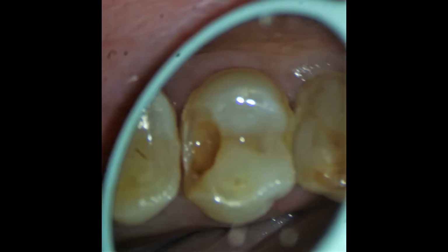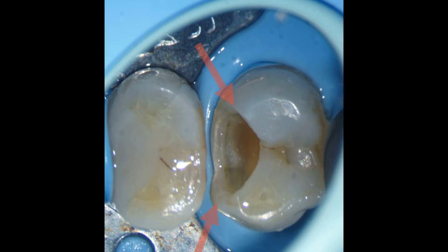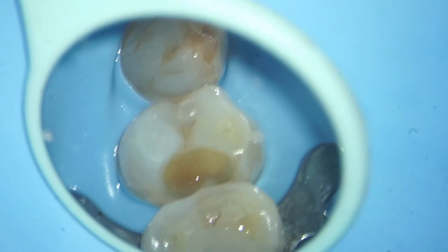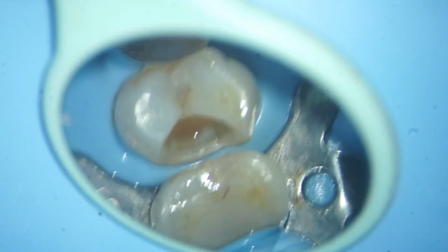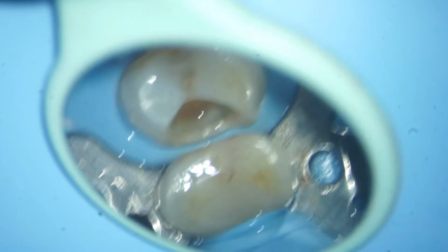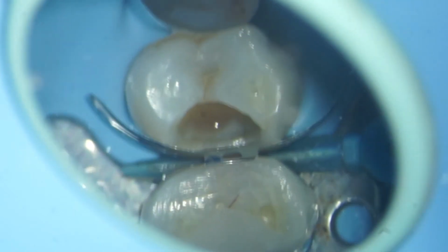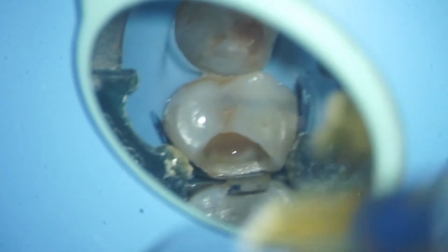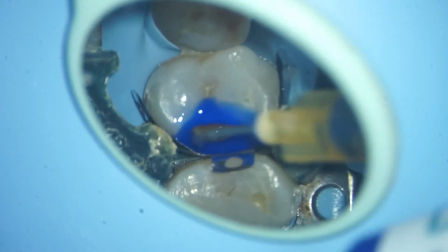We always break the contacts so that the composite and the tooth interface on the proximal sides comes to the cleansable areas. So after clearing all the cavity, we've applied the rubber dam. Now the rubber dam is well inverted and the margins of the dam are below the gingival seat. We're using Dentsply matrices and a Dentsply ring as a separating agent to compensate for the thickness of the matrix.